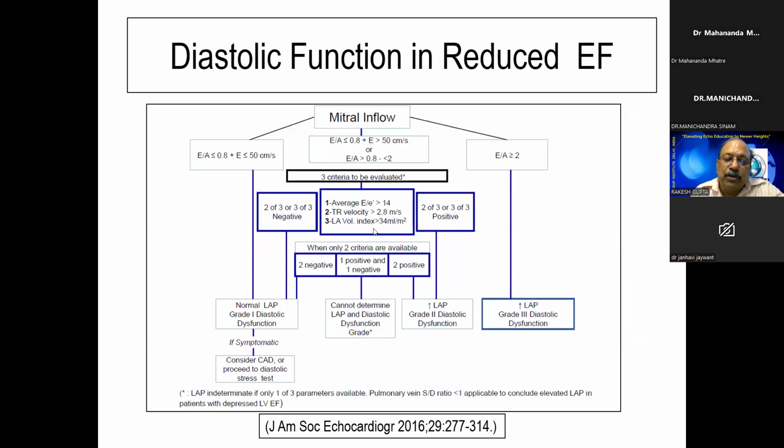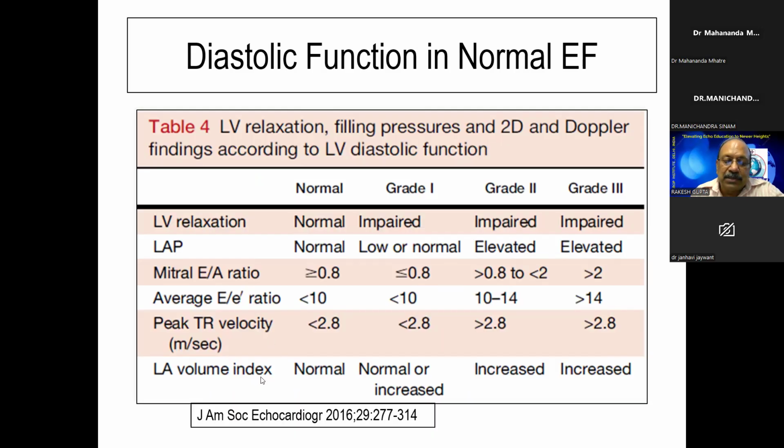And even in reduced ejection fraction, LA volume index is also a very important criterion. Index means whatever LA volume you calculate, divide by body surface area. Clear? Yes, sir. Thank you.